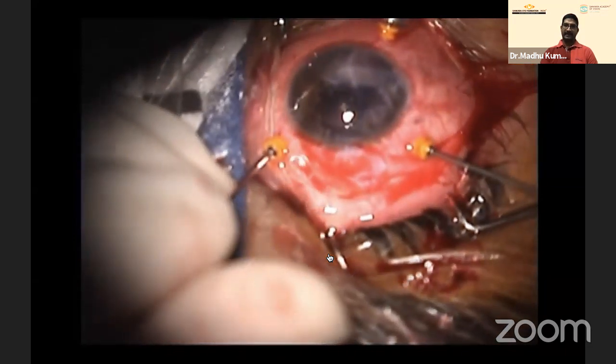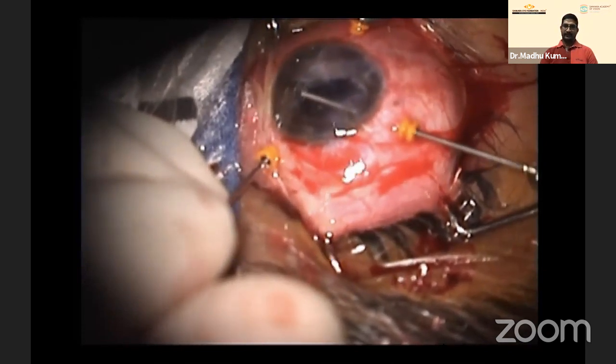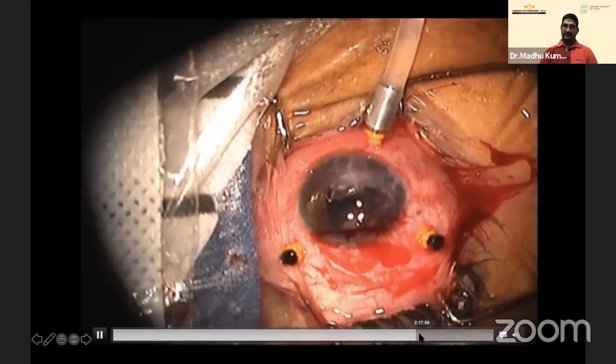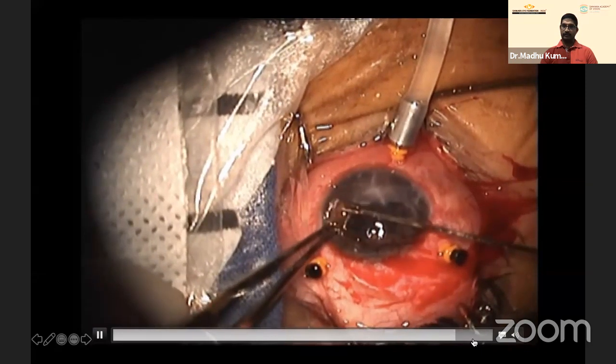Two foreign bodies were removed using visco-expression. For the third foreign body that wouldn't engage in the cutter, a flute needle — with a round end opening similar to viscoelastic needles — was used in suction mode to lift it. It was then placed on the iris and visco-expression was performed. All three foreign bodies were successfully removed.